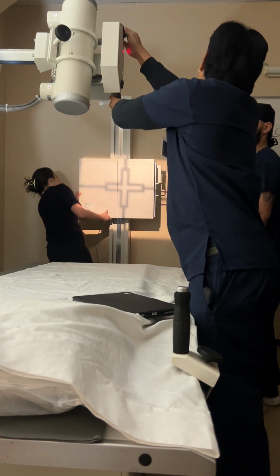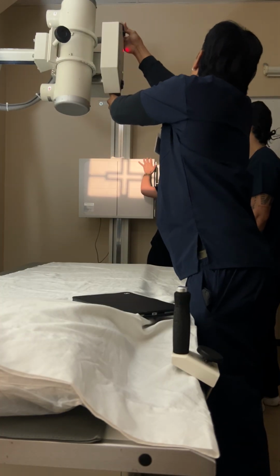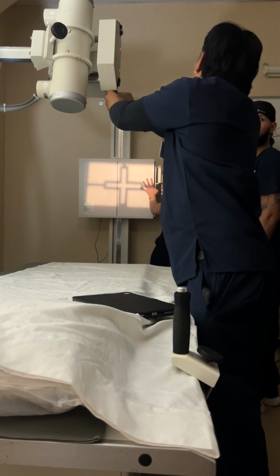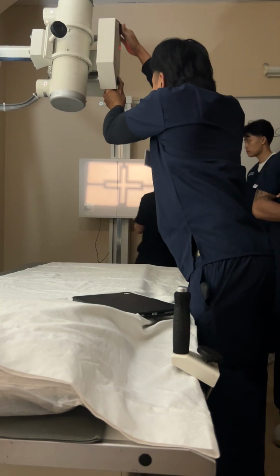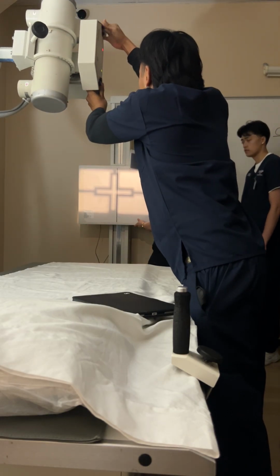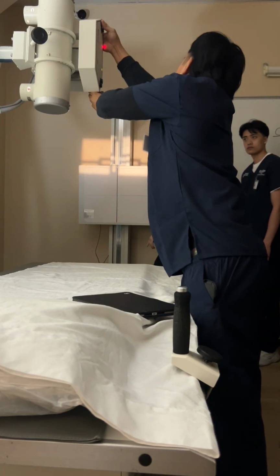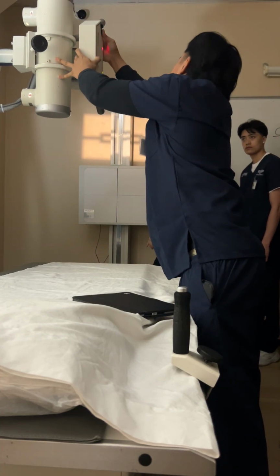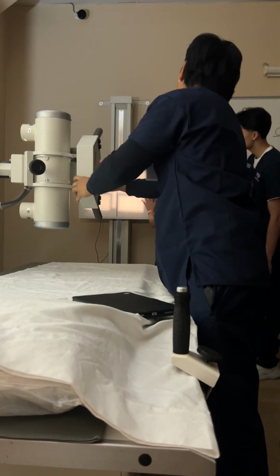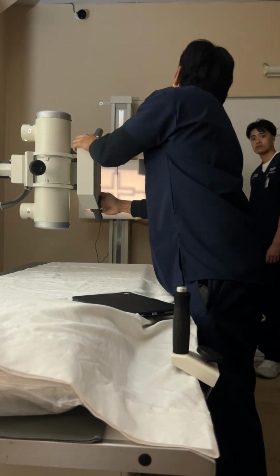Also, real quick, since we're still getting used to things, this is the IP. This is the photostimulable phosphor. Okay, so this is a CR cassette, which is very different from this, which is an old film screen cassette that I just broke. That is the intensifying screen for this 10 by 12 cassette. So we would put an actual piece of polyester film in here and expose this, and the screen would expose the film. This is a CR cassette or PSP cassette.